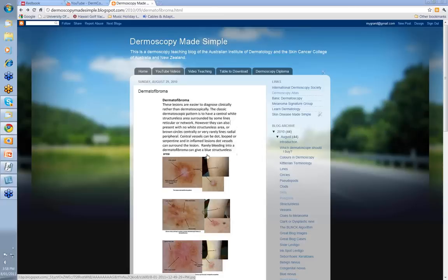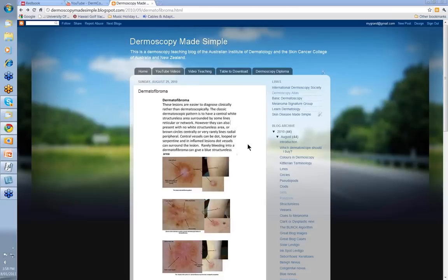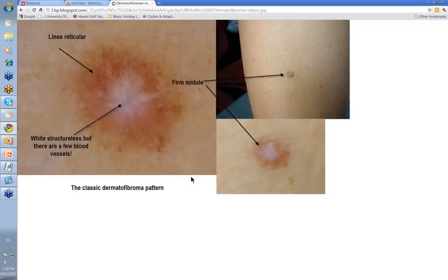The central vessels that you may see in this area can be dot, can be looped, or even can be serpentine. In inflamed lesions, dot vessels can surround the whole lesion itself. Rarely you can get bleeding into a dermatofibroma, giving you a blue structureless area. So let's have a little look at some dermatofibromas.